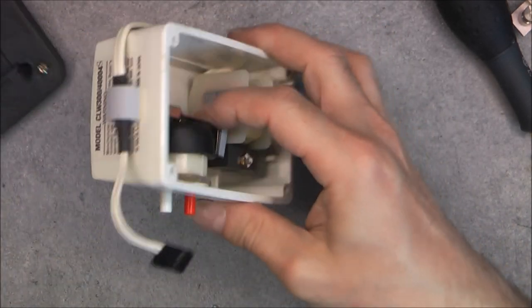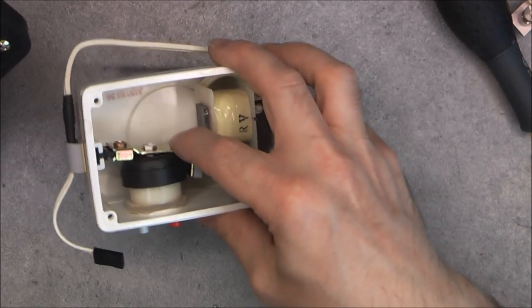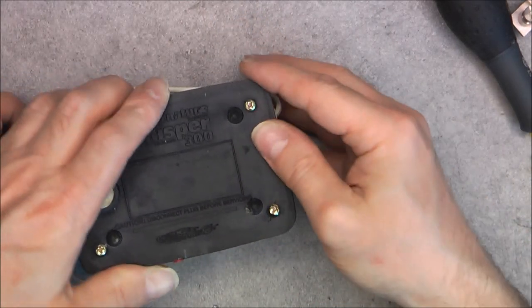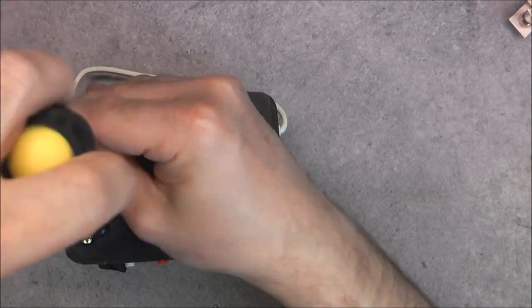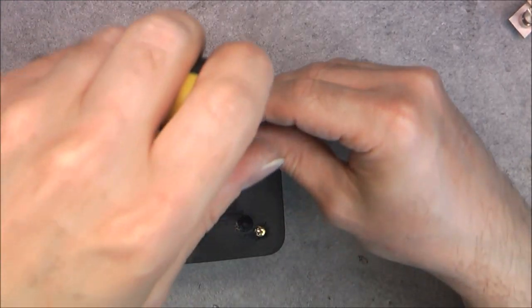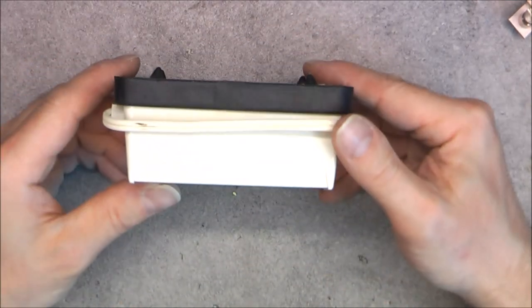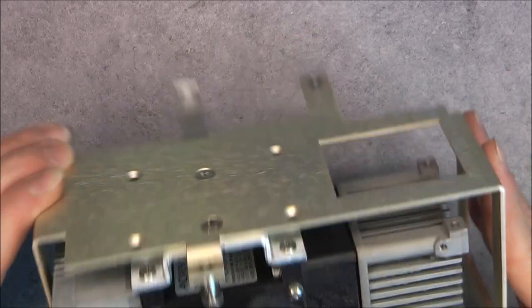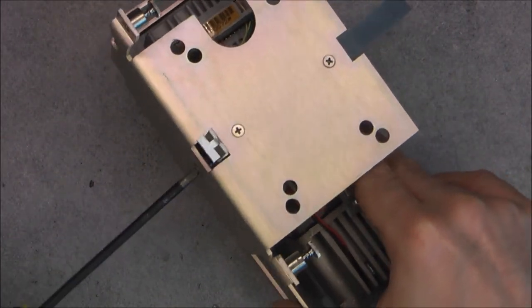Interesting. So it must be super noisy. I was not expecting this, really. An aquarium pump in a medical device. Well, quite a generic air pump that could have a number of uses, apparently. Quite fun. Okay, we are left with the most interesting part, of course, the gas analyzer, at least.